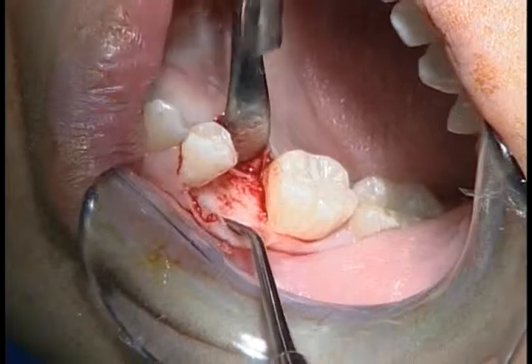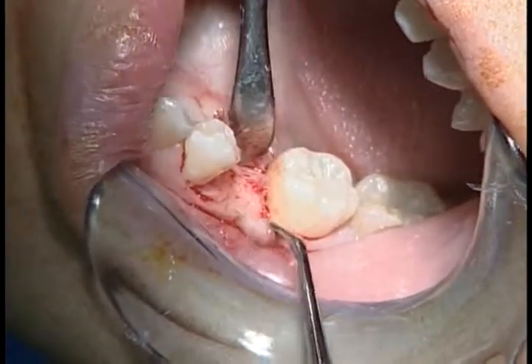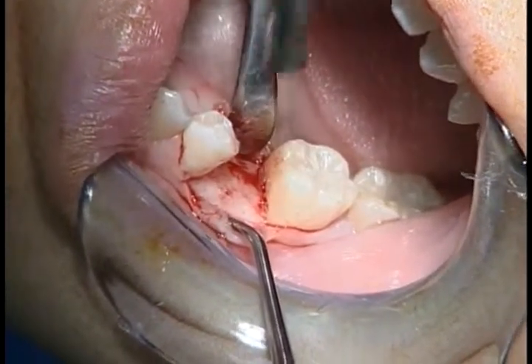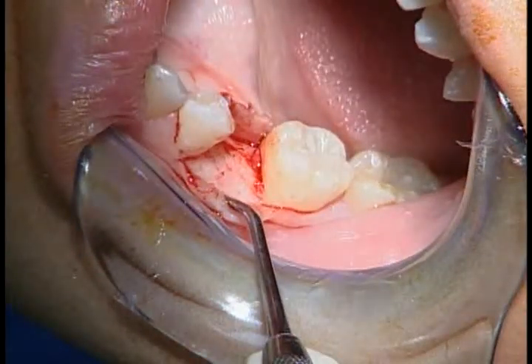Once the flap is elevated, the proposed surgical site is examined for any soft tissue tags that may be present. If there are any of these tags of tissue present, they may be removed using an elevator. Do not use surgical gauze to remove any soft tissue tags. The spicules of bone that are present in any ridge will shred the gauze and might introduce these fibers into the osteotomy.